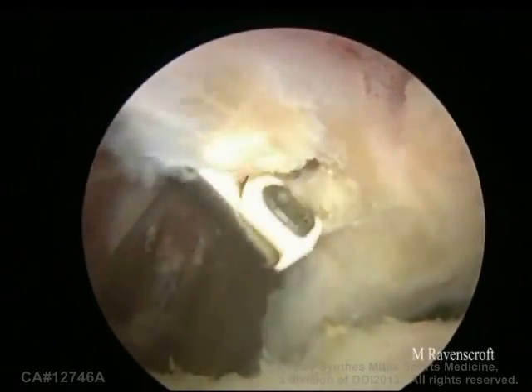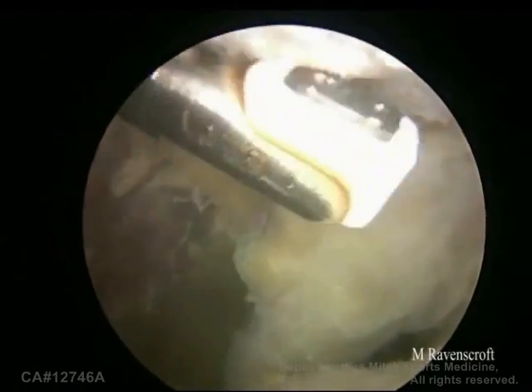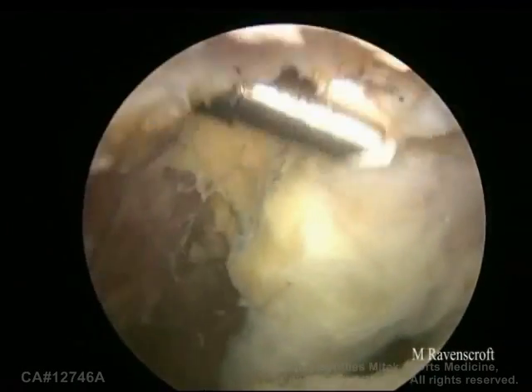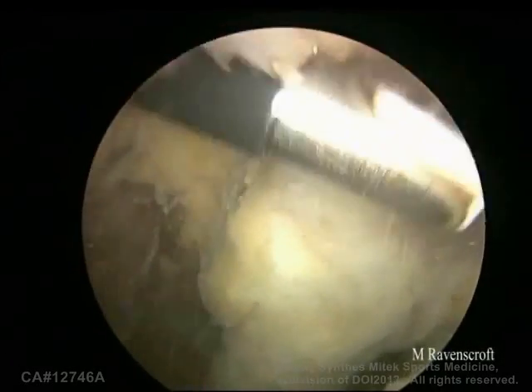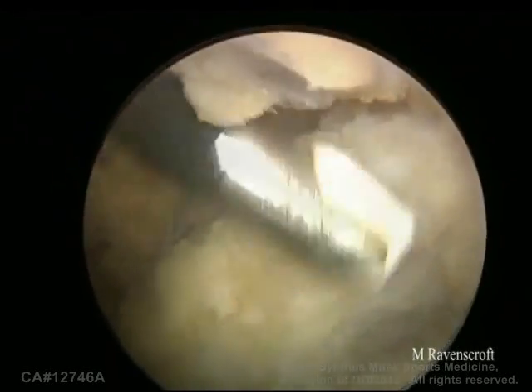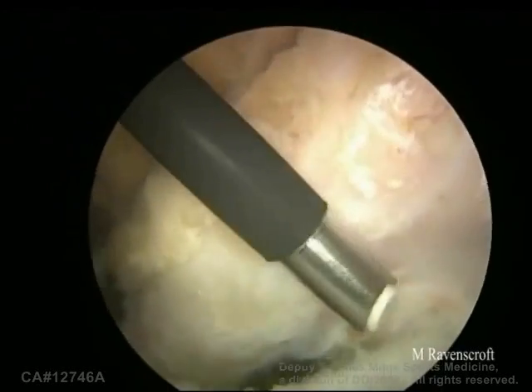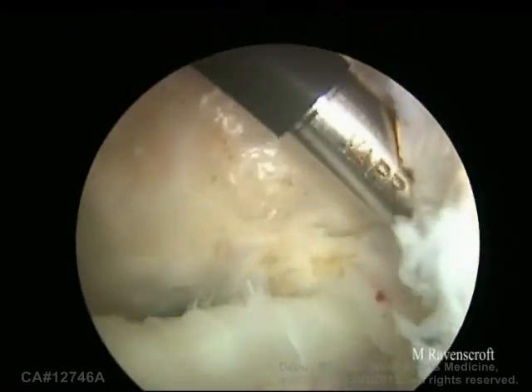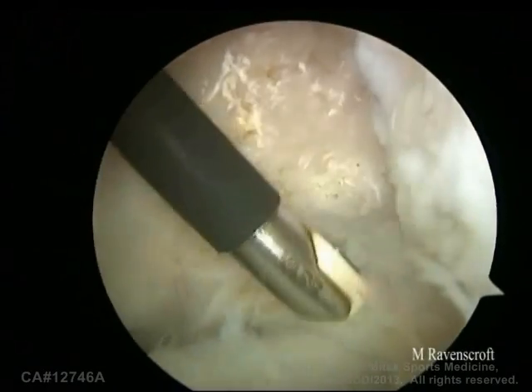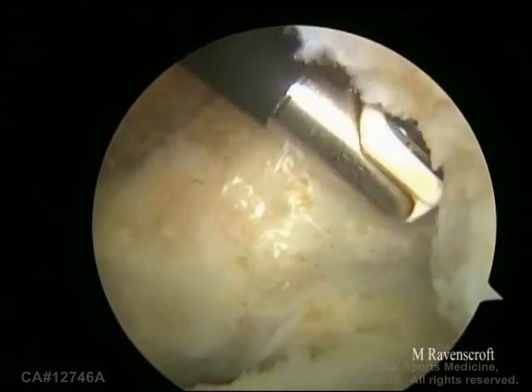This is the coracoid acromial ligament that's being removed by the vapor. This will expose the superior surface of the coracoid process. You also want to expose the undersurface of the coracoid as this will be the part that's in contact with the glenoid neck. And again work medially to clear the top of the subscapularis.